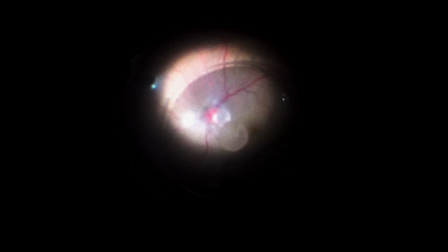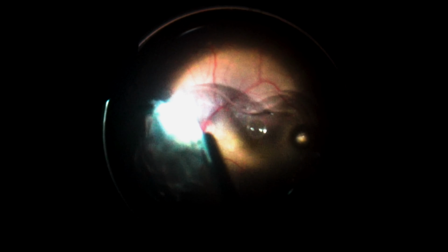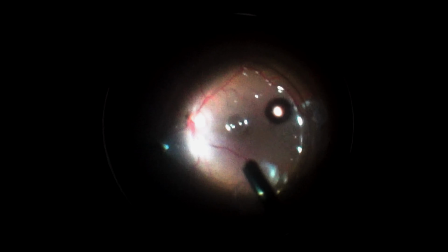We decided it was better off using a fragmatome to get rid of the lens at this time. With the appropriate settings, we could easily remove the lens. Minimal vacuum was applied at the retinal periphery.